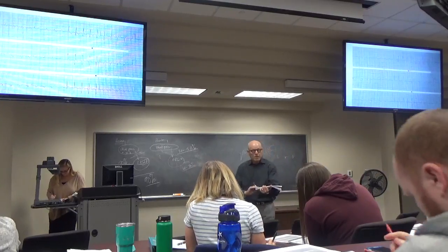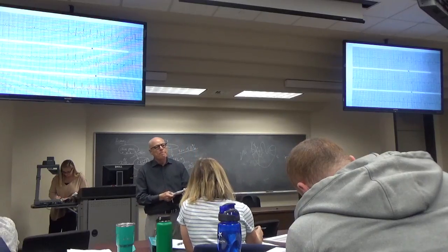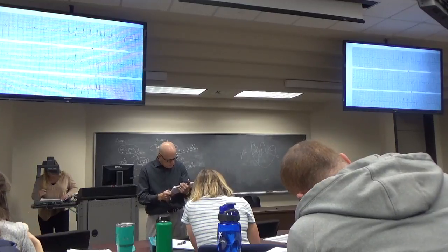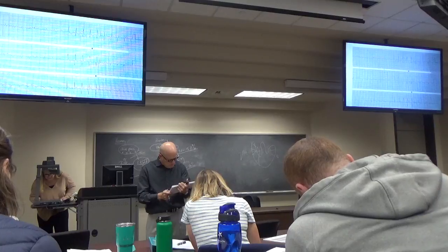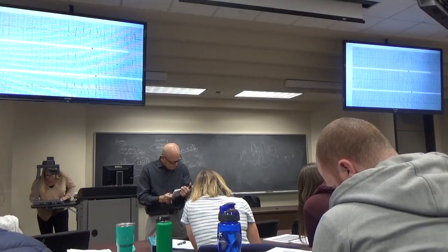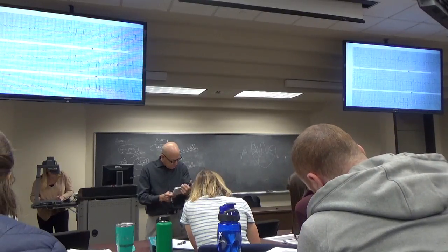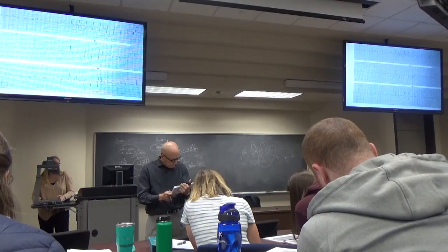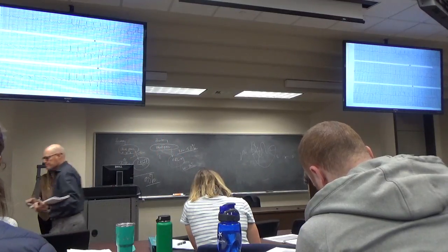Okay, anything else? I have a quick question. I said that on lead II and aVF, I saw like a camel hump T wave. Is that like ischemia? I put inferior ischemia. I don't really know. A camel hump T wave. Where? In lead II and aVF. I can show you on mine if you don't see it. I don't think I see it. I don't know what I'm seeing. Do you see it now? Yeah, I circled it, so I pointed it out too.